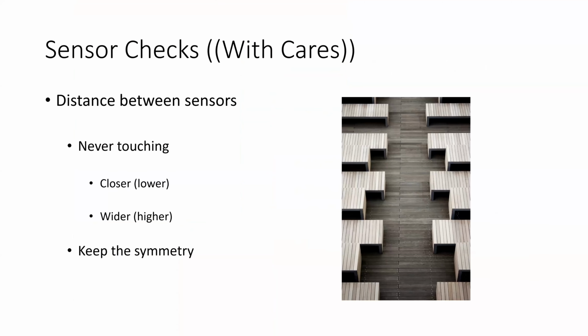When you're taking care of a baby with the sensors on, it's really important, especially if you're not using one of the pre-measured tools, the caps, to make sure that the sensors stay symmetrical, stay separated, and are never ever touching.